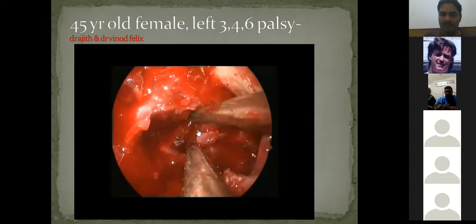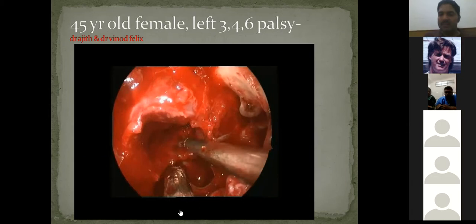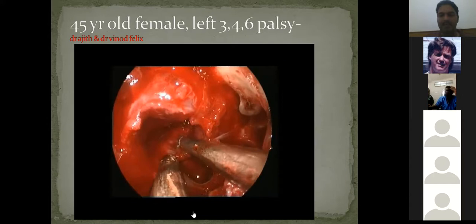And there is some bleeding from the venous confluence just behind the short vertical segment of the carotid artery in the cavernous sinus. You have the venous confluence, which is otherwise called the venous gulf. You have the basilar venous plexus, cavernous sinus, and the petrosal sinus all confluencing there. And there was some bleeding from there. You could control that with some Floseal or Surgiflo.